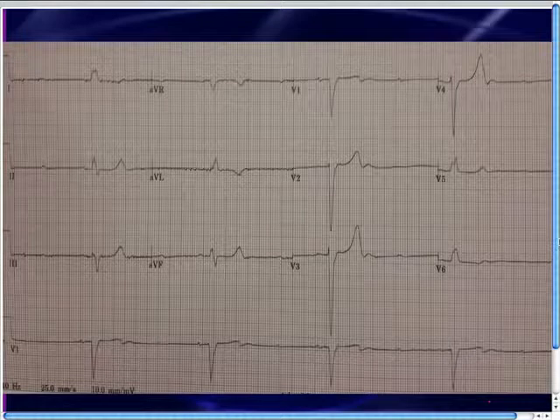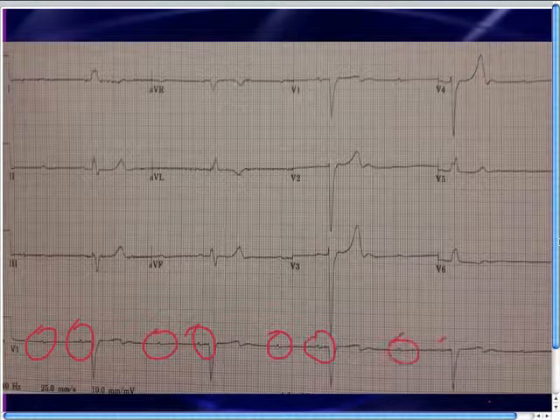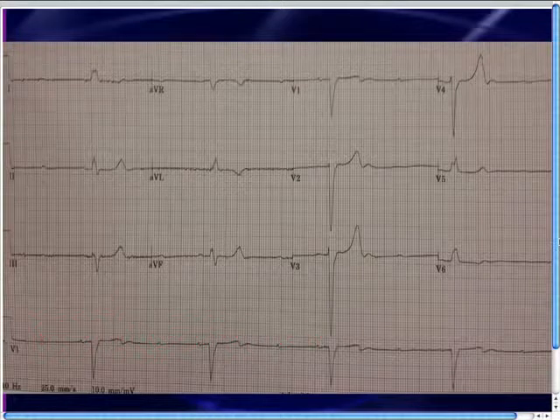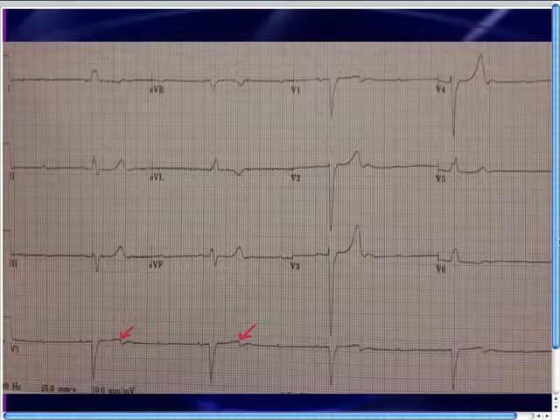First of all, this is a really slow ventricular rate, and you'll notice that there are clearly P waves that are not being conducted. I'm only circling the very obvious P waves, but you always wonder whether there's a P wave buried somewhere that you're missing. If you just go P wave to P wave to P wave, actually get your calipers, these map out very nicely. So there are P waves that are buried within those T waves, and you can actually see just a little bit of a spike on these T waves as well. That's a clue. Whenever you see pokey looking T waves, you always worry that there's a buried P wave. We've talked about that before.